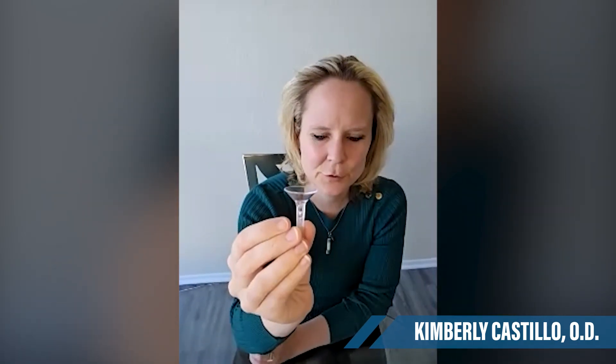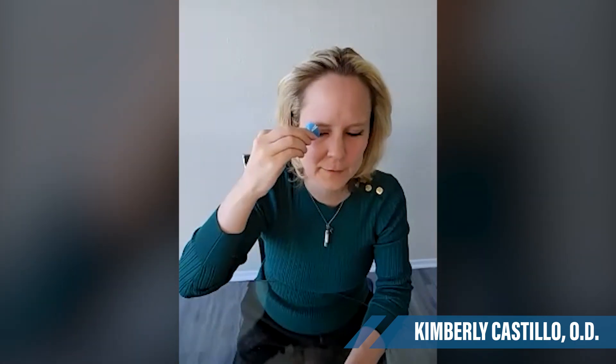What is the process once you have determined that your patient is going to get custom printed contact lenses? The process starts with creating the mold on the front surface of the eyes. We use a little device like this to inject a blue putty into the lens — they call it goo. After you fill it up, it looks something like this. Then you slip this onto the eye and wait for a minute. Then you take it out, and the mold will look something like this. We then take this mold, send it into the lab, and the lab analyzes the data and creates the customized lens.